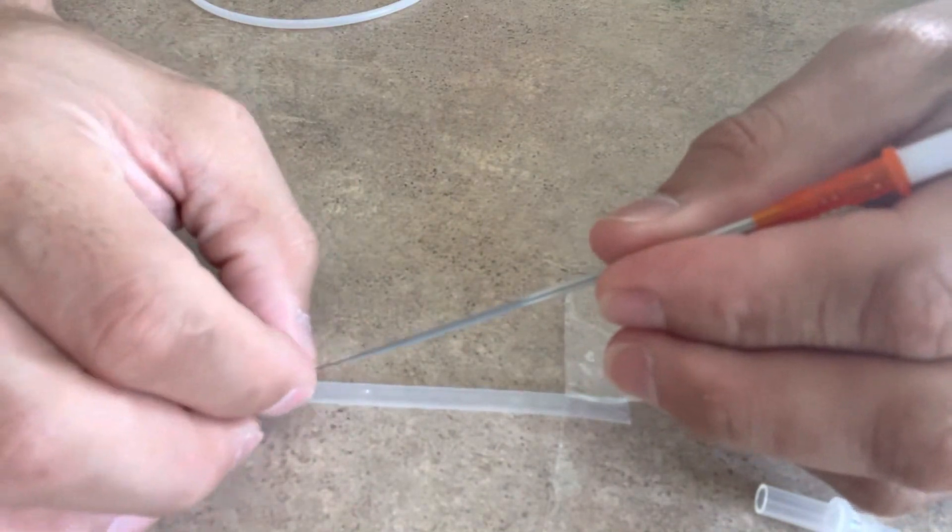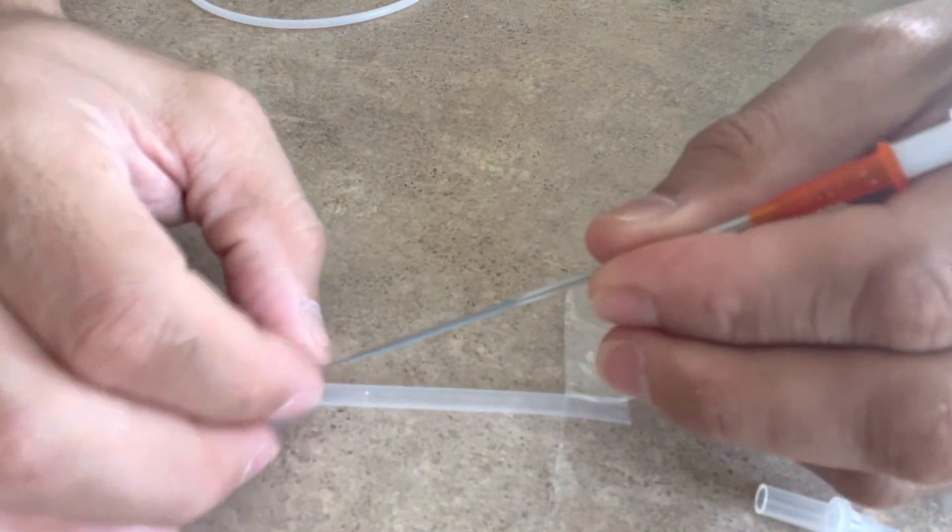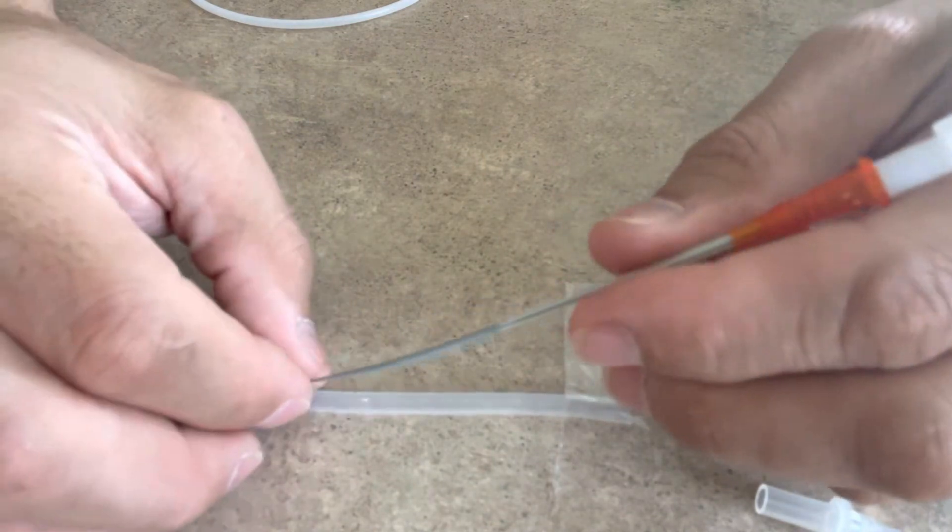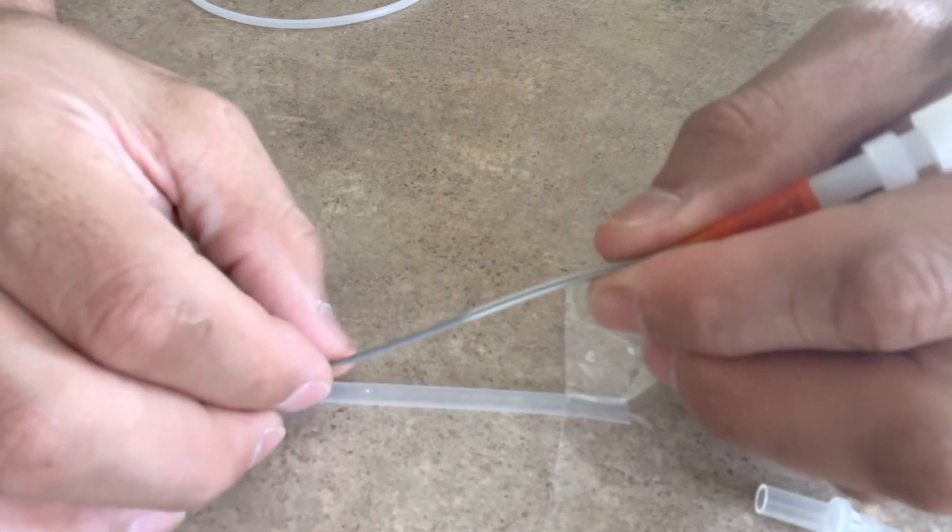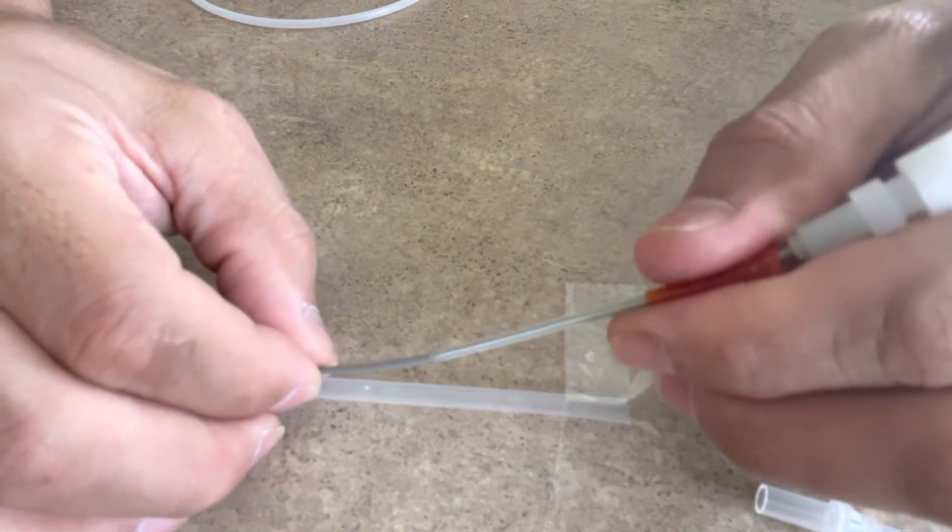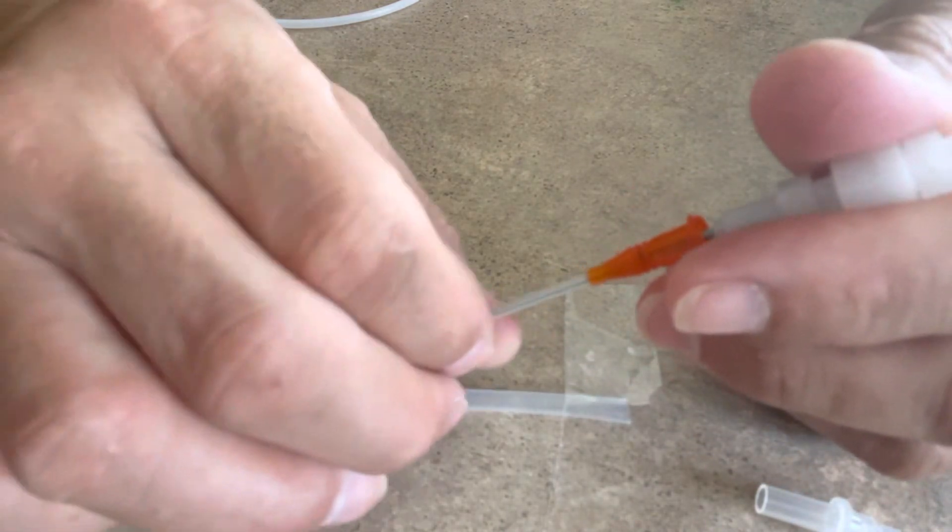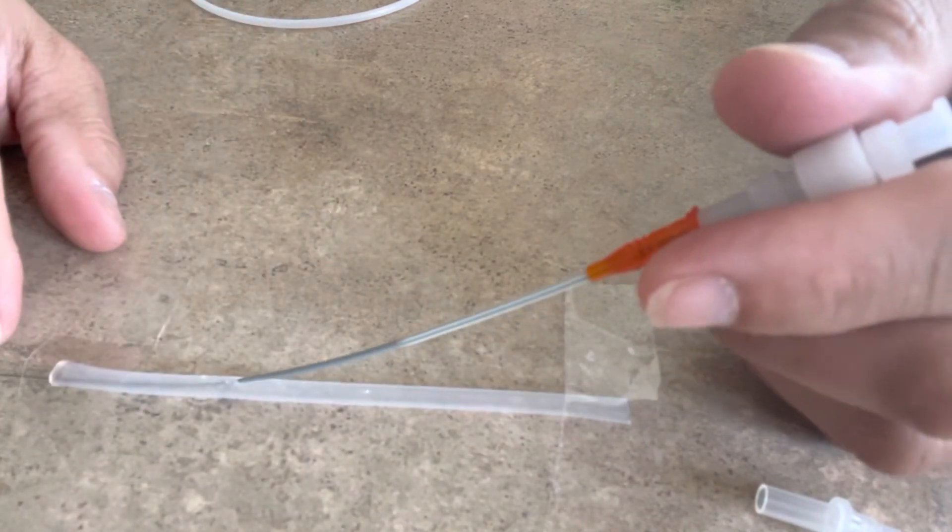And things you might notice right now as I back my wire out is that this dilator is actually very flimsy. And so there's a technique I use to prevent some of that, because if you just push, you can actually bend the wire and the dilator pretty easily.